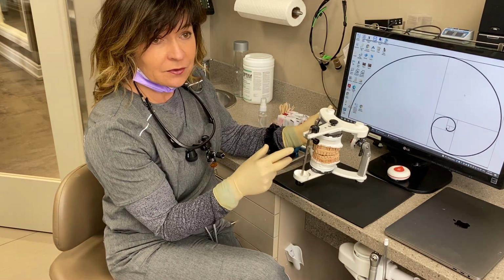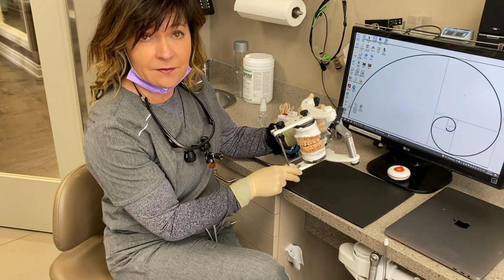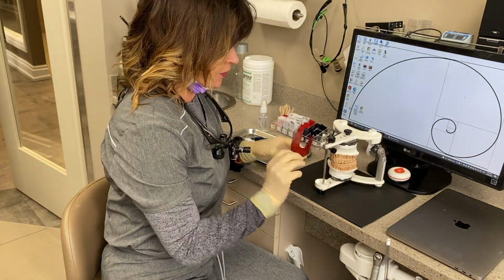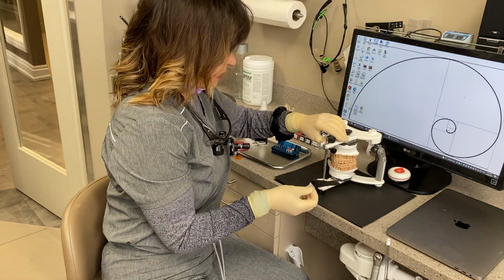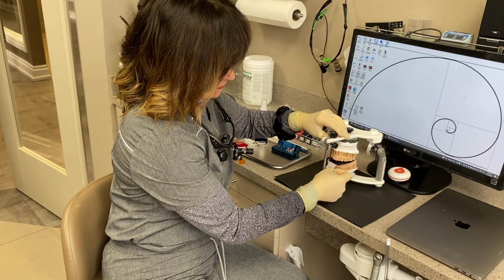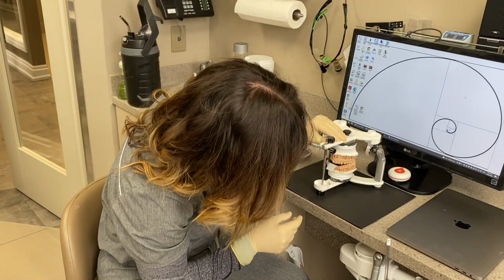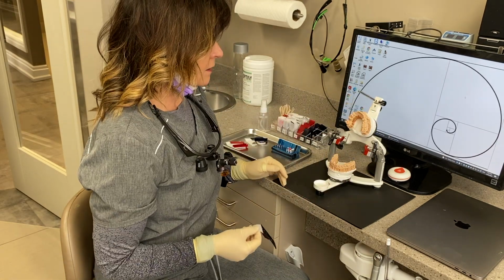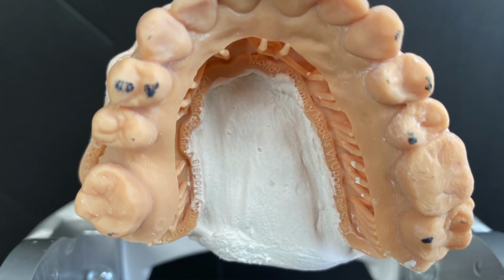So I'm going to show you the basics of diagnosis and the analysis of a bite, and then some ways to treat these conditions. A lot of the time I'll just mark the bite on the initial touch. So this is articulating paper. It has red ink on one side and blue ink on another. I essentially just place it between the teeth and do a couple of taps to mimic the patient's bite, and then open it up. Right away, you see contacts very heavy on the tooth right there and the tooth right there.